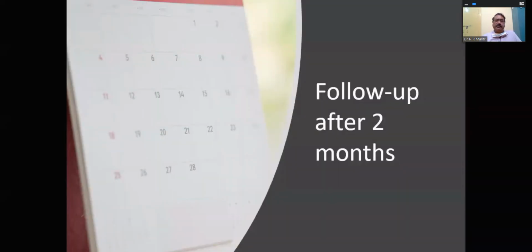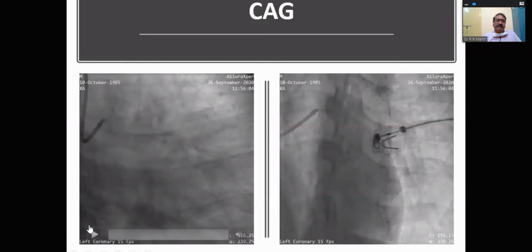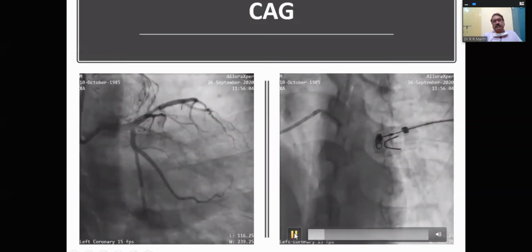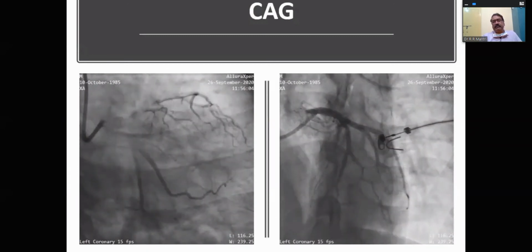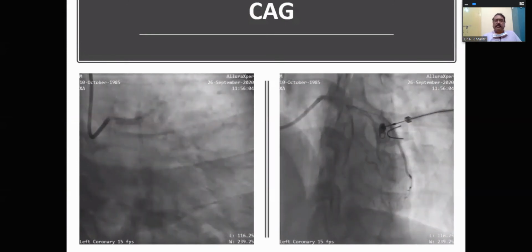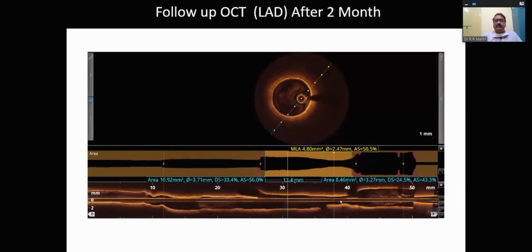Follow-up after 2 months, the patient remained asymptomatic. These are the angiographic pictures. So no visible intraluminal filling defect. And this is the OCT run. Now the surface looks very smooth. There is a thick fibrous cap. The side branch ostium, which contained thrombus, all thrombus has practically disappeared, and there is a smooth lumen. There is, of course, some non-lumen-compromising atheroma.